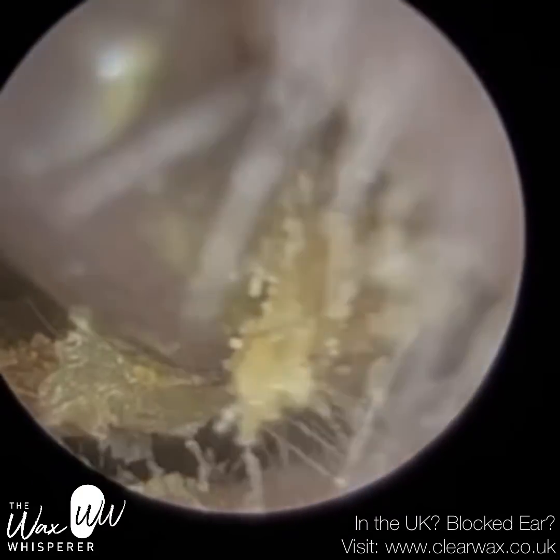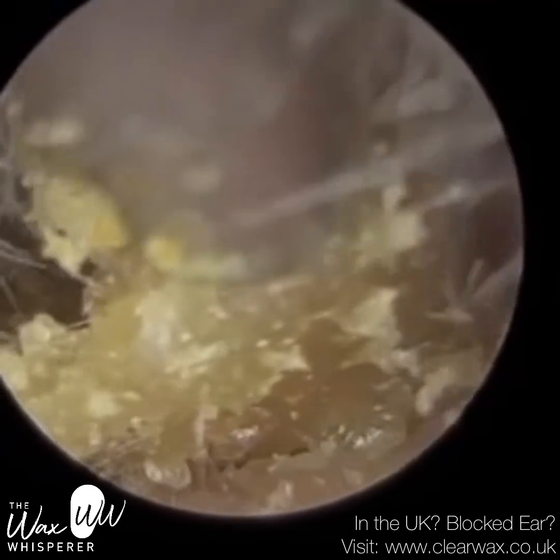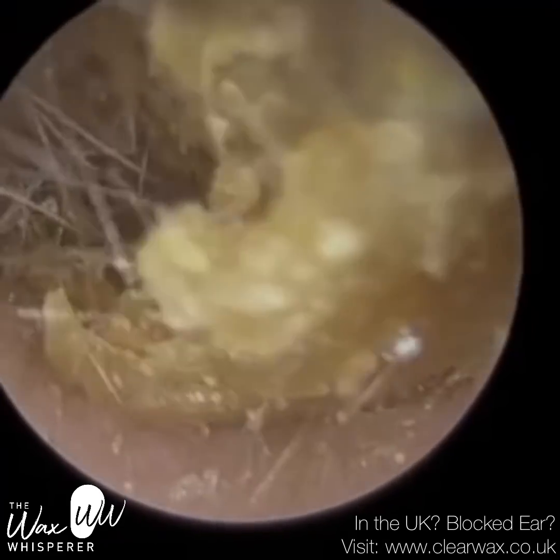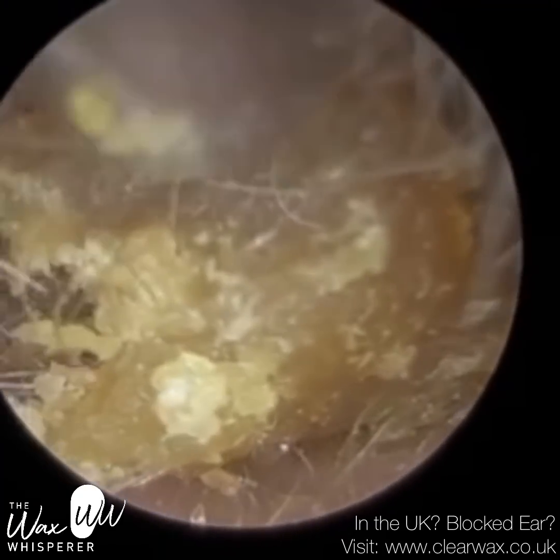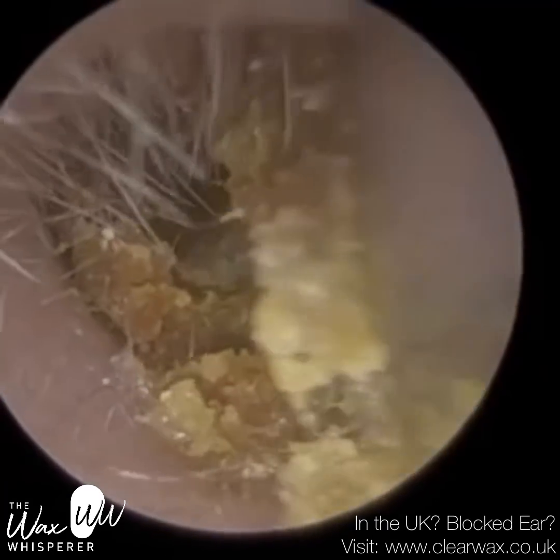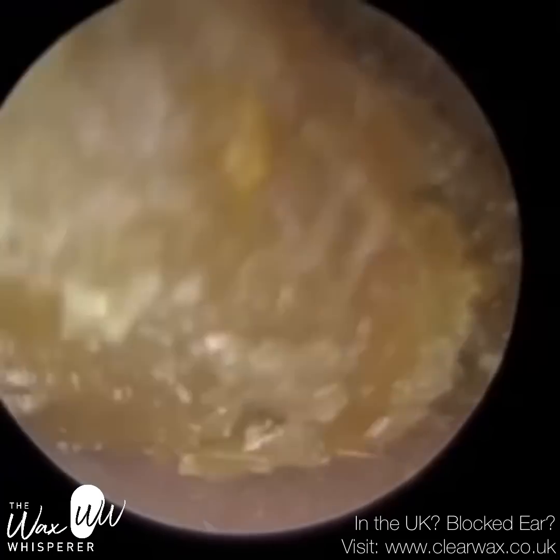In the UK, I would say maybe 10 to 20%, but probably more towards the 10% — one in ten. So a microscope or head loops are used, and that's where you have a speculum to stretch and widen the ear. The view is naturally narrower, but I've discussed the shortcomings of both a microscope and head loops in detail in previous videos, hence why there needs to be another device on the market other than an endoscope.